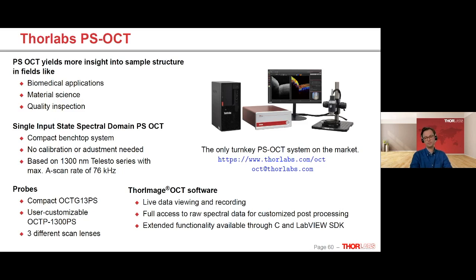It is not weakening our signal, because we can mix in just a little bit more light, so our detectors are saturated to the level that we require.